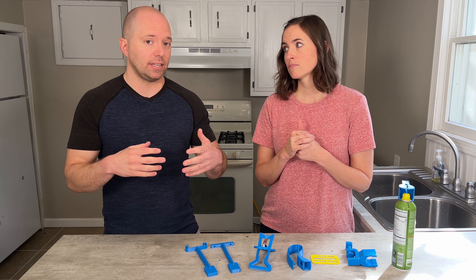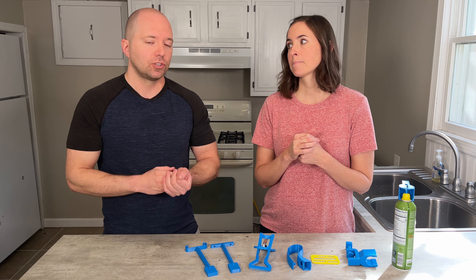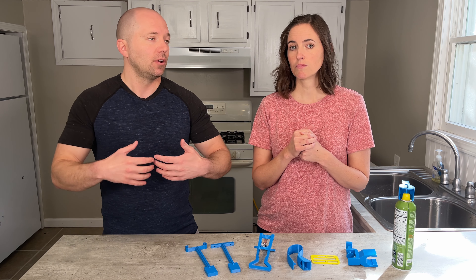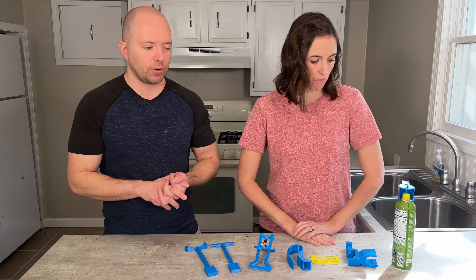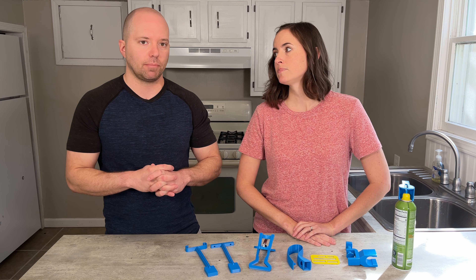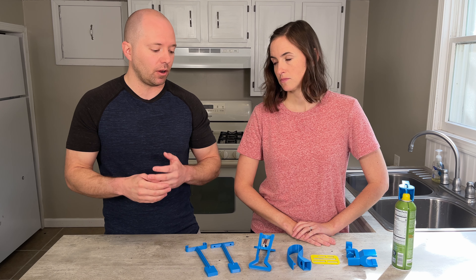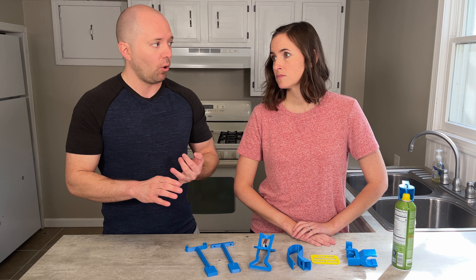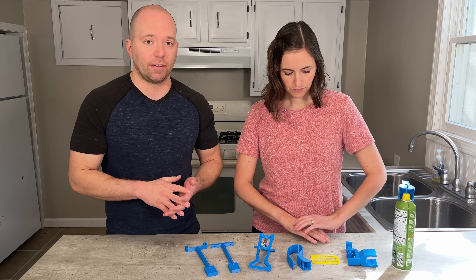These are products you don't have to design yourself — you just have to find them and print them. When it comes to 3D printing, a lot of times you'll be looking for what's called a 3D model or 3D design that's already been made by a designer and made available online. One of the most important things when looking for a model is to make sure how easy it is to print — and how do you know what to look for?